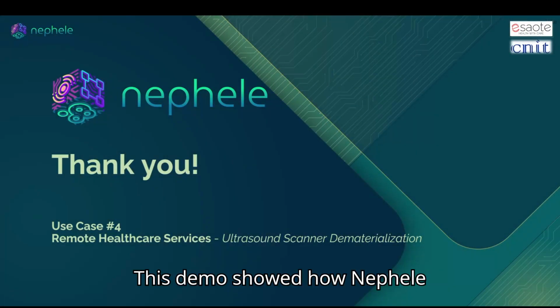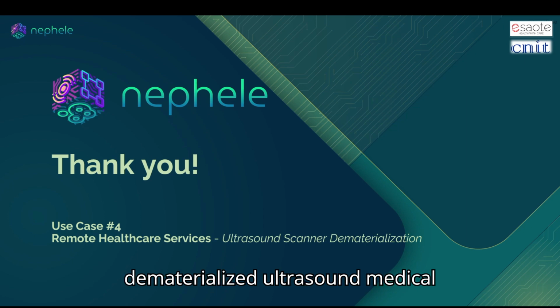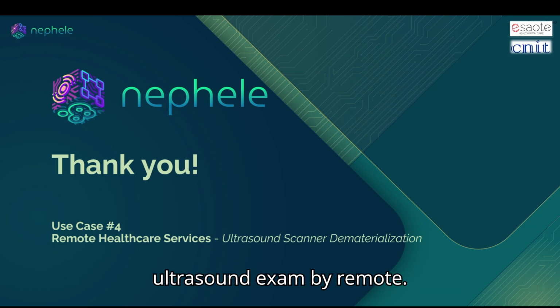This demo showed how Nephele infrastructure allowed building a dematerialized ultrasound medical solution for showing and controlling an ultrasound exam remotely.